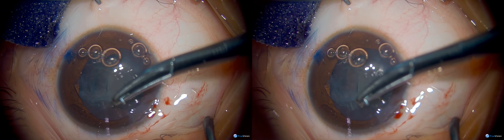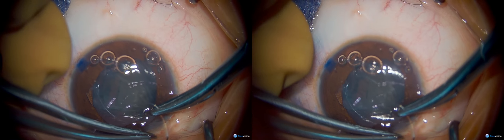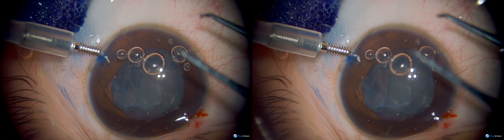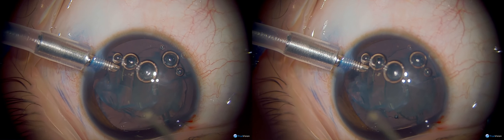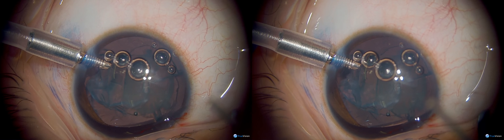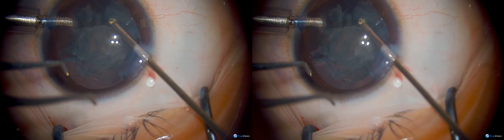Here you can see sutures being placed over the incision because we're using a vitrectomy handpiece and an infusion cannula. If you do that through a larger 2.5 millimeter incision, which was utilized for the capsulotomy, you'll have too much leakage around the vitrectomy handpiece, so you'll want to close that incision down slightly. Alternatively, if you have access to a small incision capsulorhexis forcep, you can do this through a simple MVR blade width incision and not have to place the suture — that's ideal if that instrument is available.